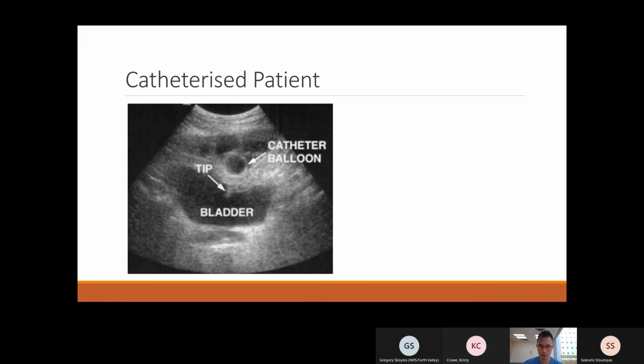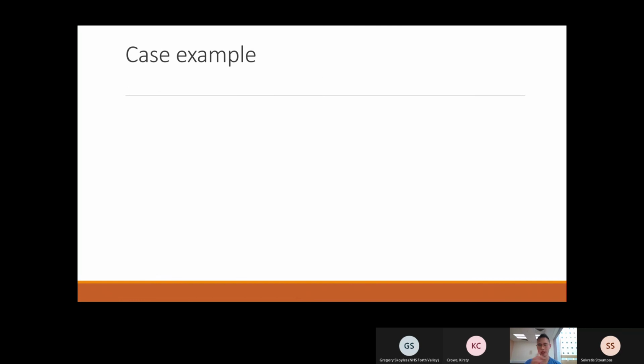So I find it very helpful. Today, I had a patient in 4A who is a hemodialysis patient and supposedly does not really pee. He's got a raised, rising CRP, and we can't find any source at all.